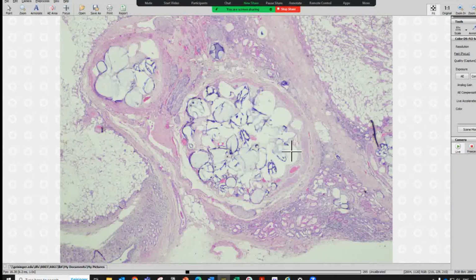And from the history, this patient had a kidney transplantation. So do you have any guess of the history of this patient? After they took out this tumor, why did this patient need a kidney transplantation? Any thoughts on the history you want to share?